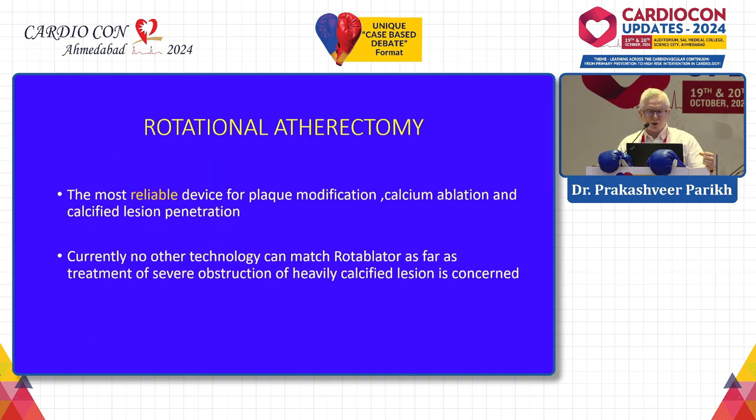So in my opinion, rotational atherectomy is the most reliable device for plaque modification, calcium ablation, and calcified lesion preparation. Currently, no other technology can match Rotablator as far as the treatment of severe obstruction of heavily calcified lesions is concerned. Thank you.